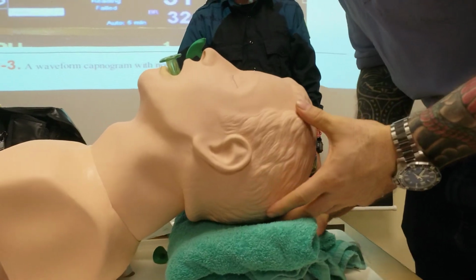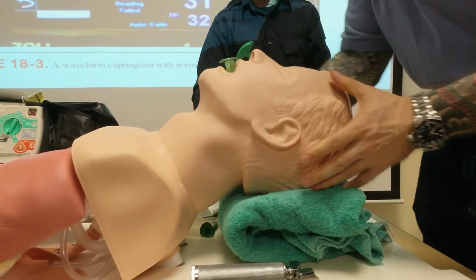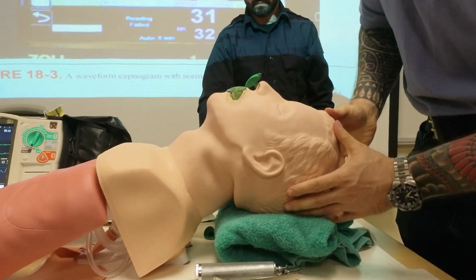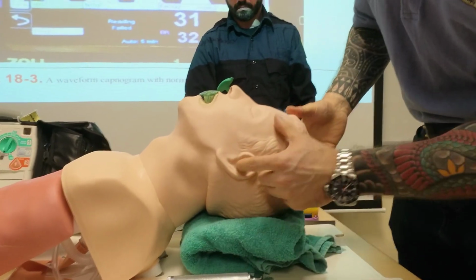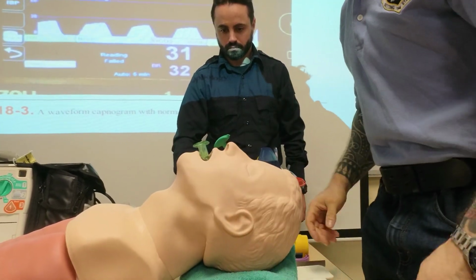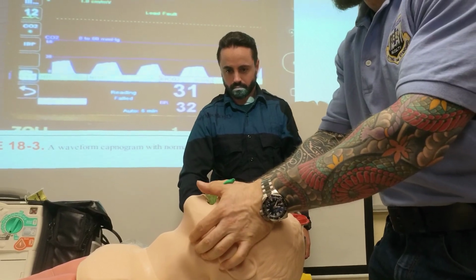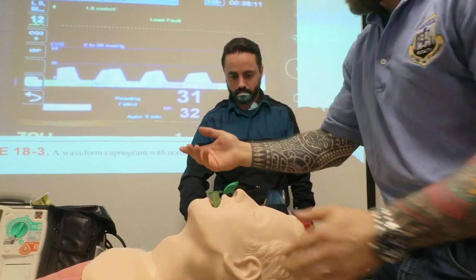But the book says not to use a curve for a child or an infant, only use a straight. For now we're going to focus on an adult. So what's the goal here? I want to have the ear hole to the sternal notch. While this is being prepared, obviously we are providing ventilation, so maybe my partner is putting the padding on and all the other stuff.